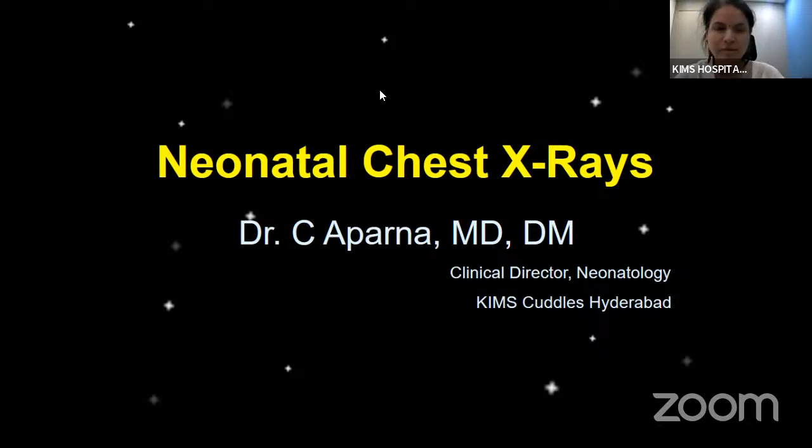One and all. So this is Dr. Aparna this side, Clinical Director Neonatology and Consultant Neonatologist Pediatrician from KIMS Cuddles, Kondapur. We are very happy to meet you on today's session, which is going to be on the utility of chest X-rays in neonates. So over the next 45 to 50 minutes, we hope to take you through some common indications for performing X-rays, a systematic approach for the interpretation of X-ray in newborns. And we shall be discussing a few abnormal X-ray findings with the specific context in neonatal respiratory and hemodynamic management.